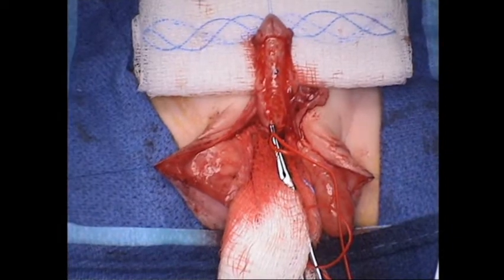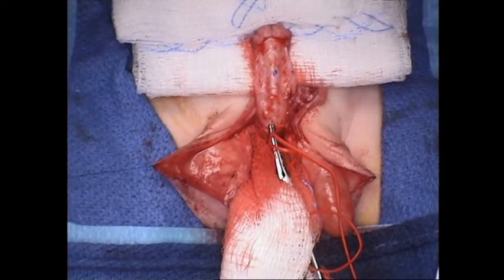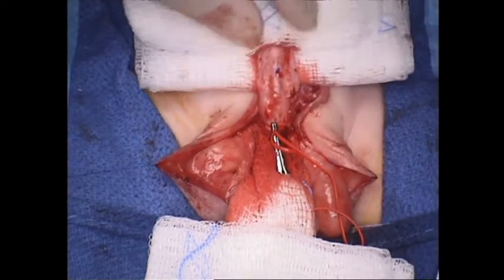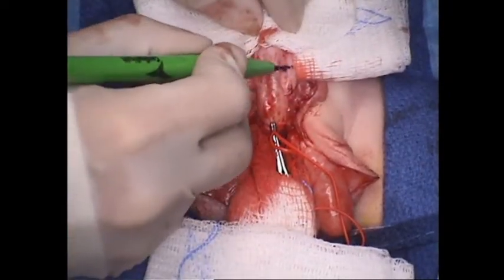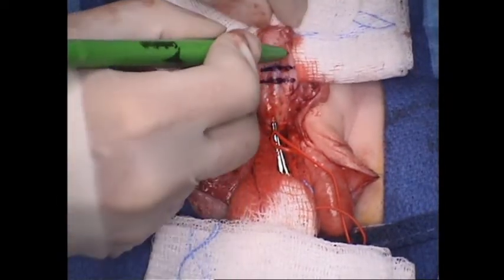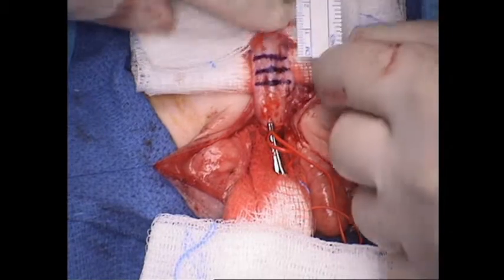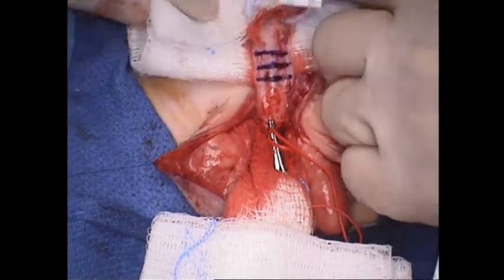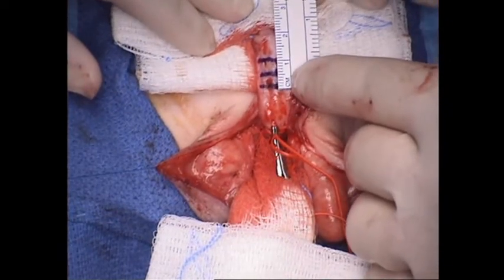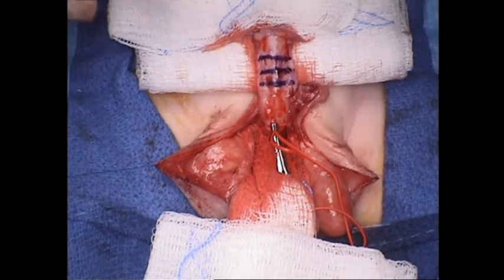We've published our success rate in having correction of curvature without recurrence in 98% of patients. We've done well over 100 of these, including in adults who have reported to us that they have normal erections following the procedure, so we're not concerned about sexual dysfunction being induced by these. Typically, we make these marks about 4 millimeters apart based on the middle one, and typically it's about 1 centimeter long, as you see here, before we make the incision.